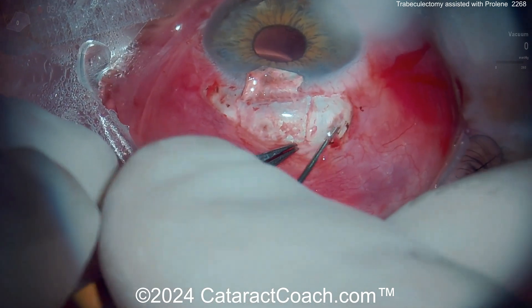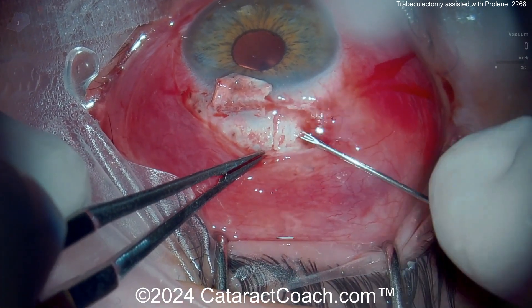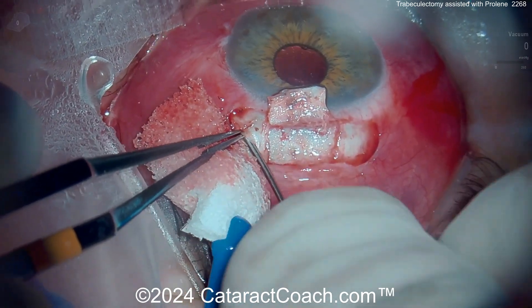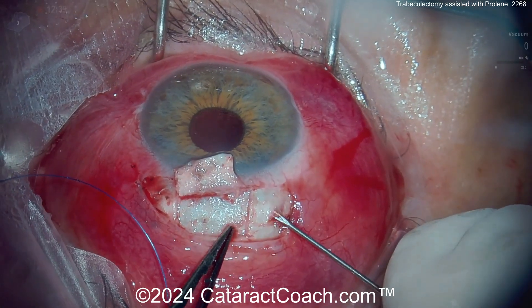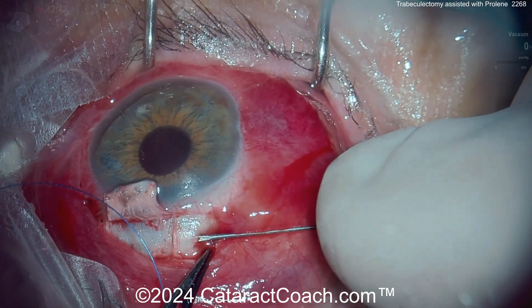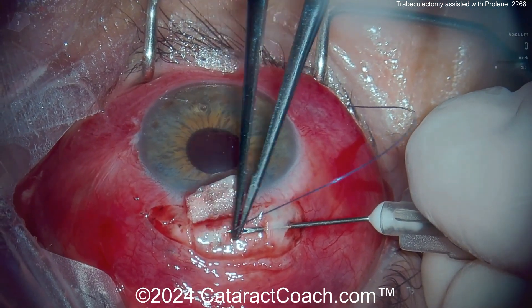Our authors are now using a needle to create a little pocket on either side of that scleral flap — you can see the scleral flap for the trabeculectomy. On the other side again, now putting a hollow bore needle there and creating a little path, and then through this going to feed in a proline suture.